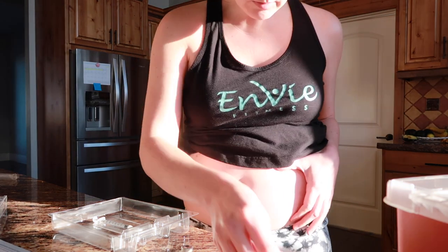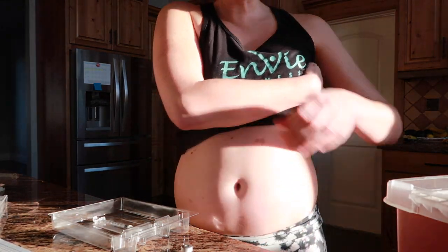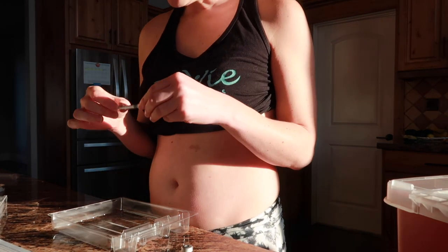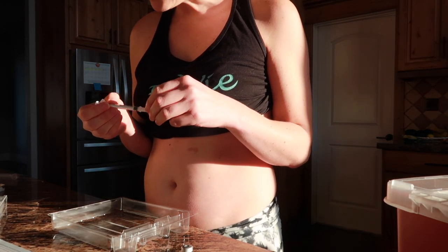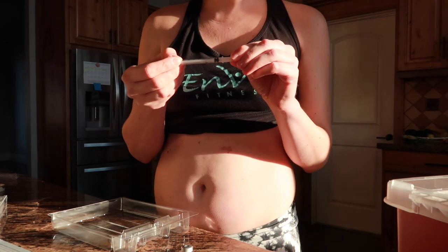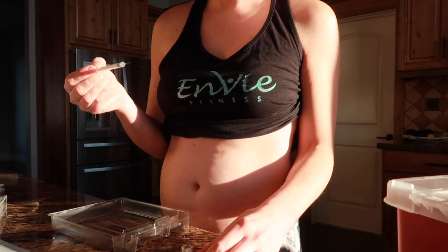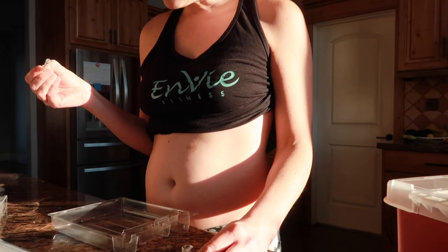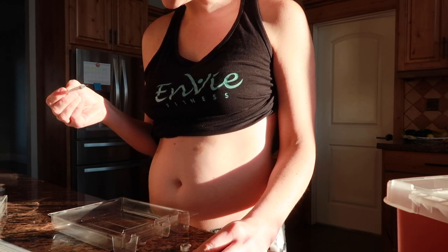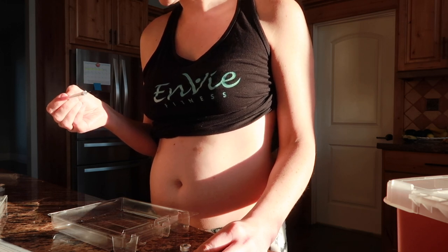You're supposed to switch spots every time to minimize the discomfort, especially if you're doing multiple injections. So firmly hold the vial and pull the needle cap off — cap is off. I'll probably want to keep that for after. Firmly hold the vial of liquid on a flat surface and insert the needle through the marked center circle of the rubber stopper.